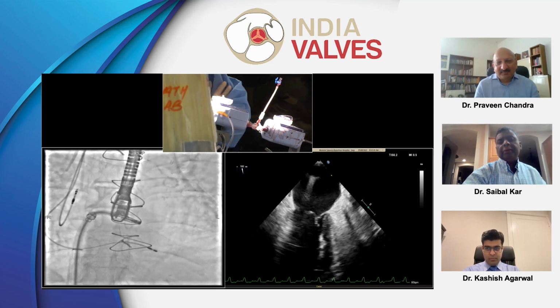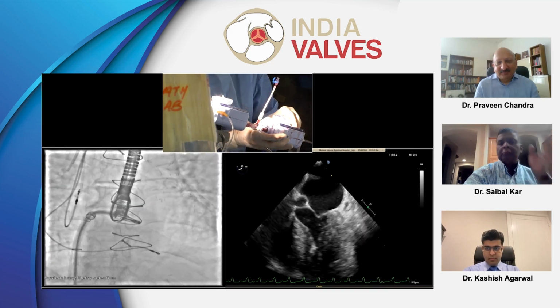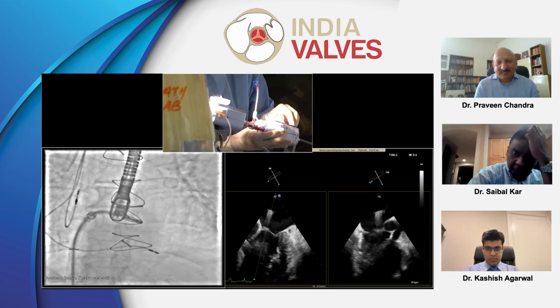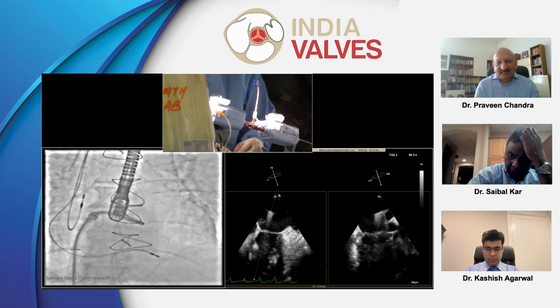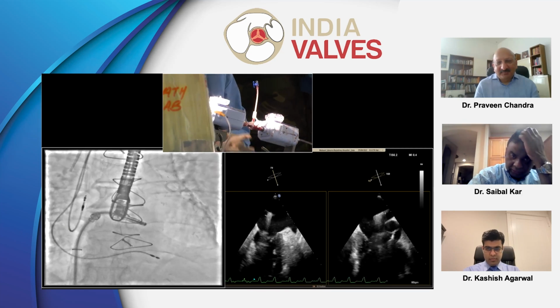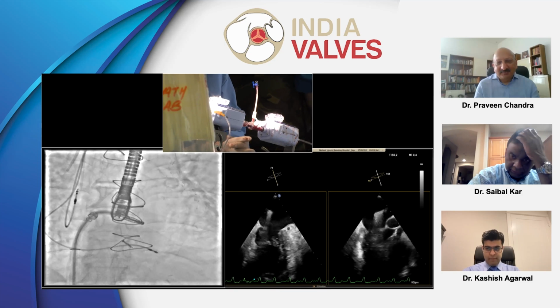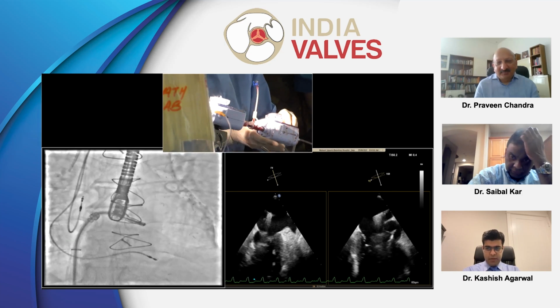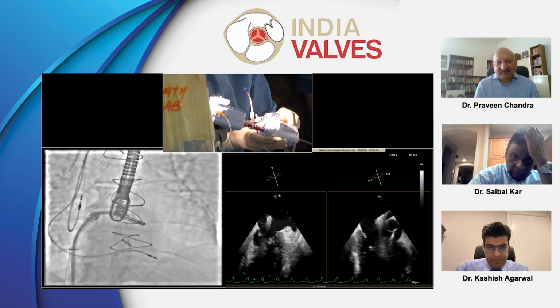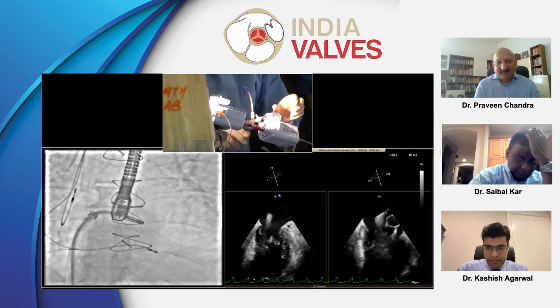Okay, Prashant. Explain that. Can't explain the bicommissural view. See how it's a wall hugger? Yes, it's coming close to the aorta. Yeah. Because of the anterior puncture. So give plus to the guide. Yeah, I'm going to give plus to the guide.